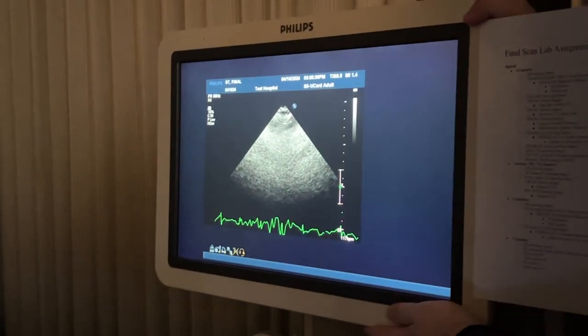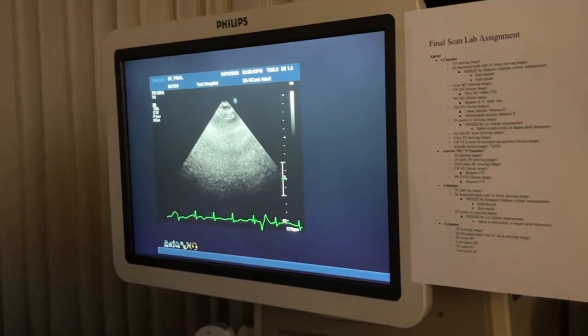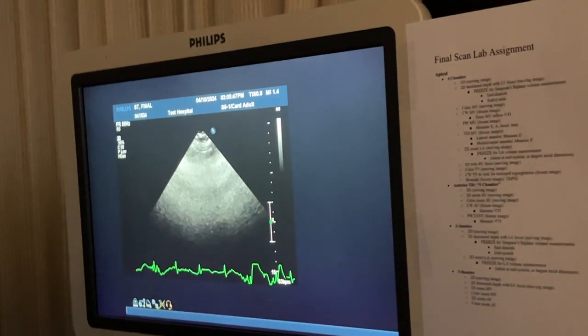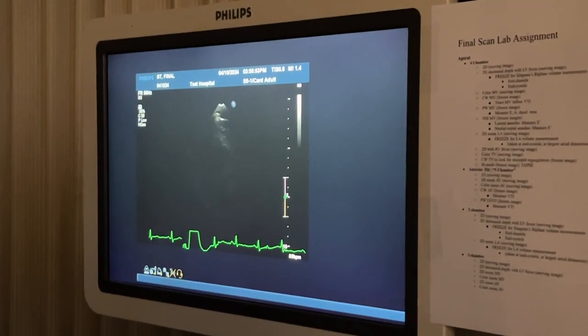Just a little bit. So yeah. Nice. Okay, this is all apical, so I should probably have you lift your arm a little bit more, and then I don't think I'll need this out. I feel like I've been back and forth between wanting it out, but I'll let you know. So we'll start here. I just go up under the tissue.